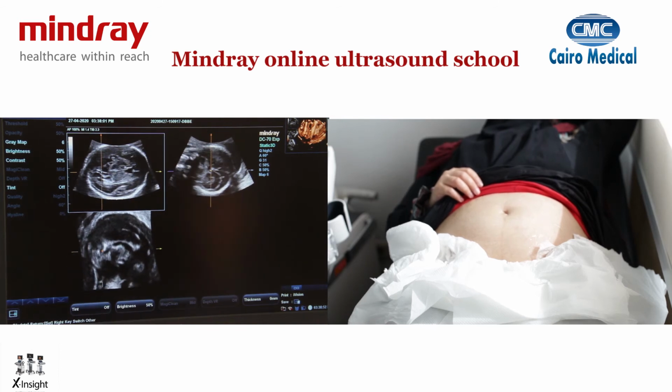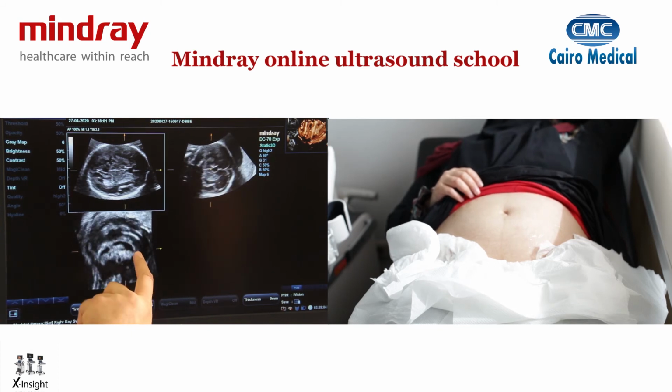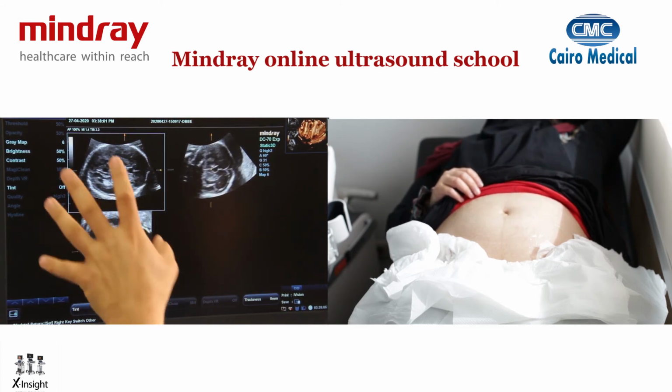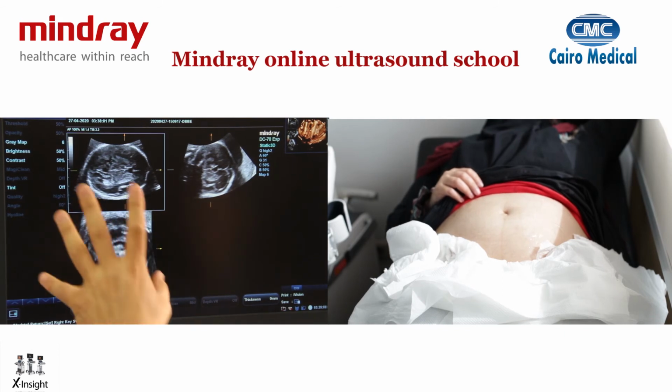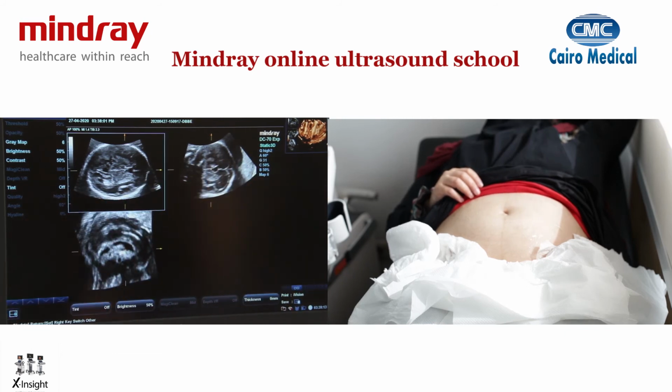So let's move a bit more and adjust our image. And as you can see here, you can see the peduncles of the cerebellum. If I want to focus on the midline, I can actually see here the fibers of the corpus callosum. So by using the multiplanar way, I've been able to modify my slices where I'm cutting across the baby and accordingly see different structures that I could not have obtained in a single 2D image like this one, by taking a sweep and taking a volume of images and moving across them.